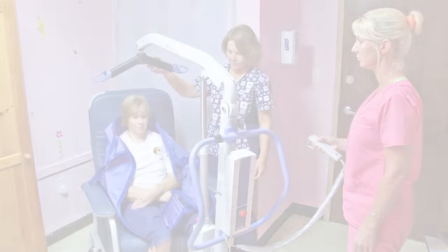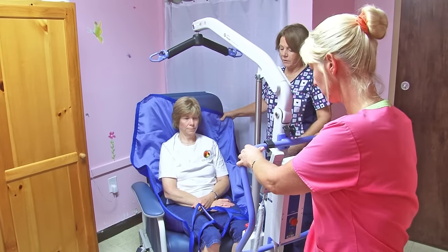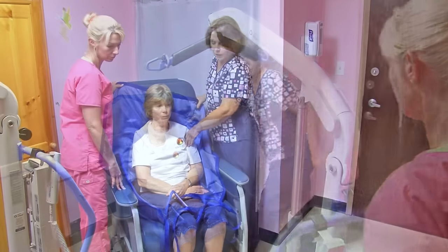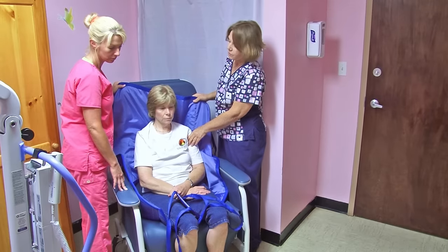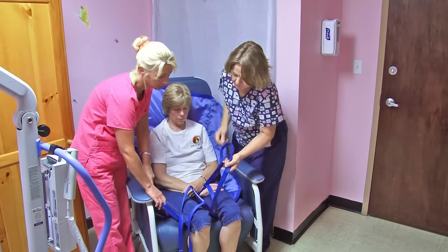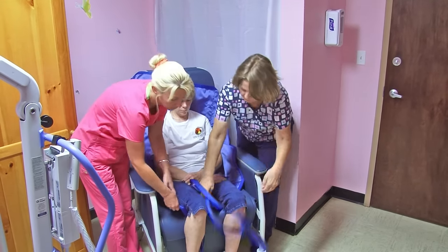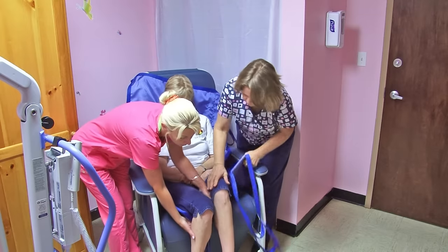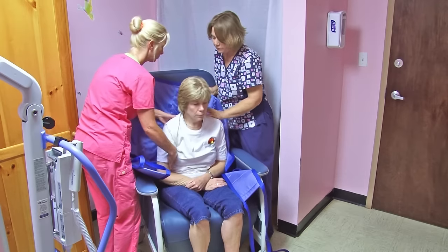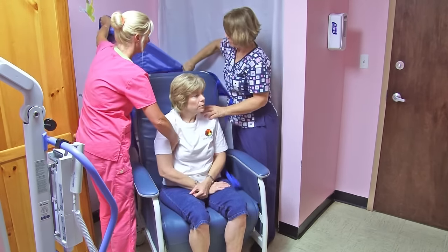Remove the Hoyer Lift from the resident and then remove this — move it that way. Now we're going to remove the sling from behind the person and under the person. First you have to uncrisscross the legs, and it helps to slide it under a little bit so it's out of the way. Now you can ask the resident to move forward and we can remove the whole sling.